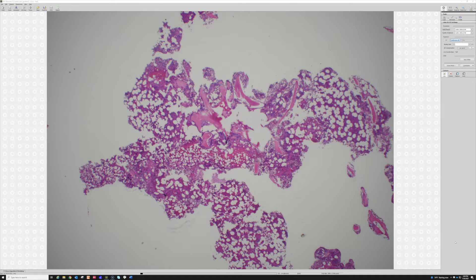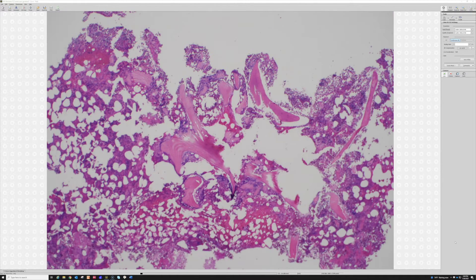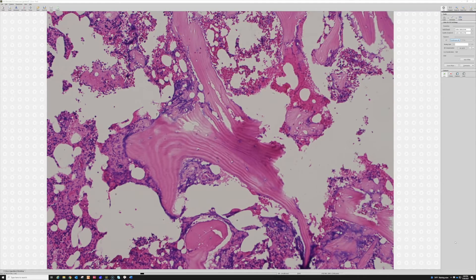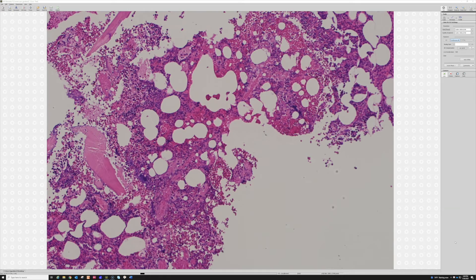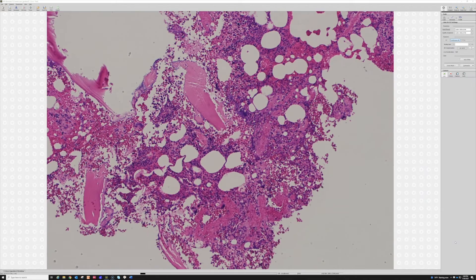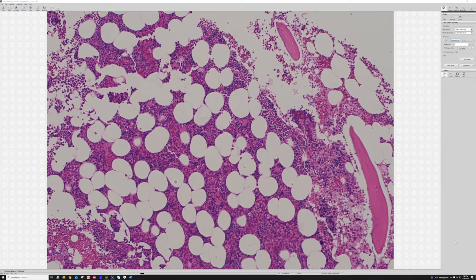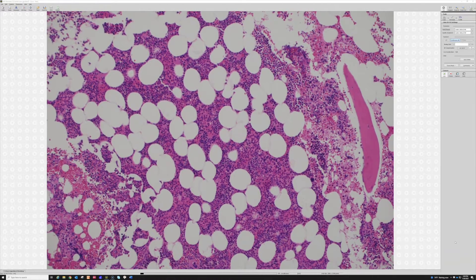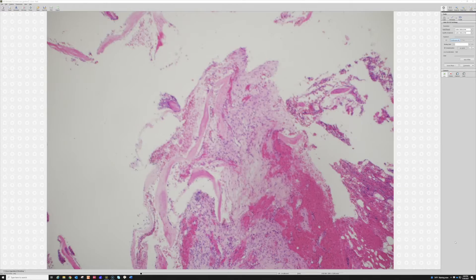Here are some bone fragments, and there's some nice concentric lamellar bone — that's what mature bone is made of. There's a bunch of marrow in between it, and if you want teaching about marrow you'll have to have someone else do it, because I do not know much about heme path and marrow anymore.